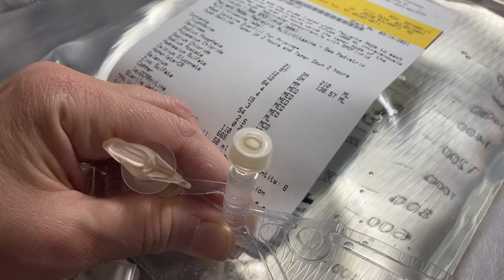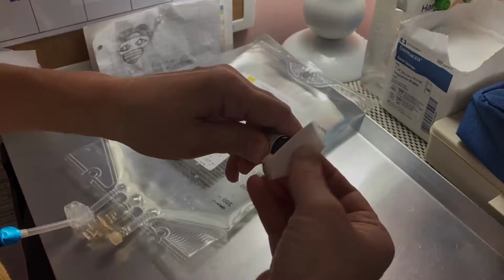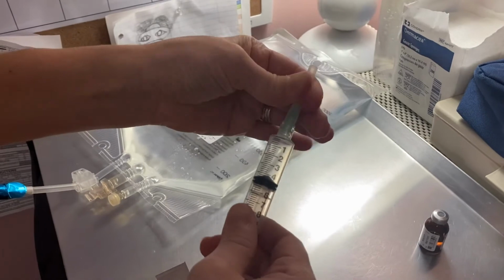There's an inner circle showing the target as to where to aim the needle to make sure it goes in straight. Insert the needle in the center, trying to keep it as straight as you can, and push the plunger. I put the cap back on the needle. Repeat the process with the larger vial. This time, you will pull back to 4 milliliters.